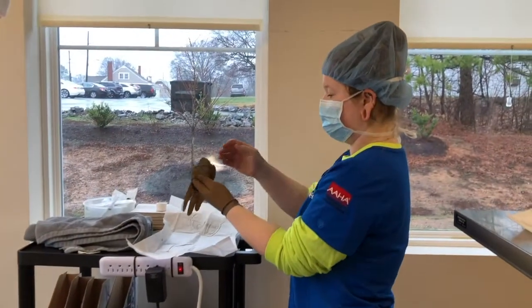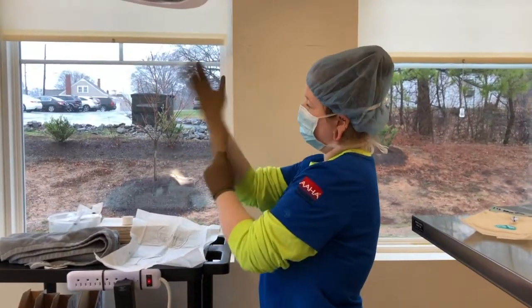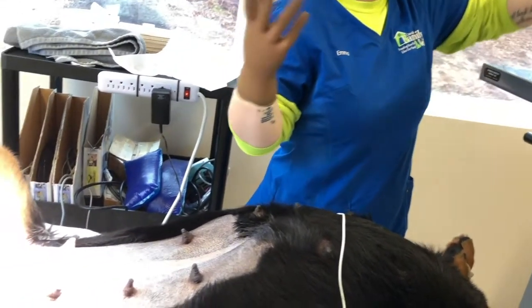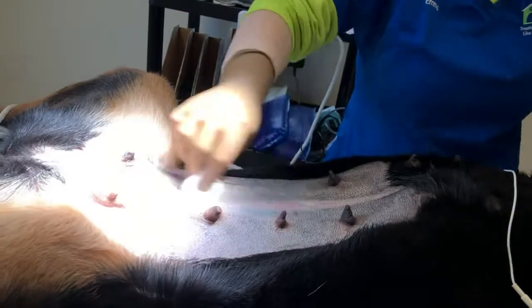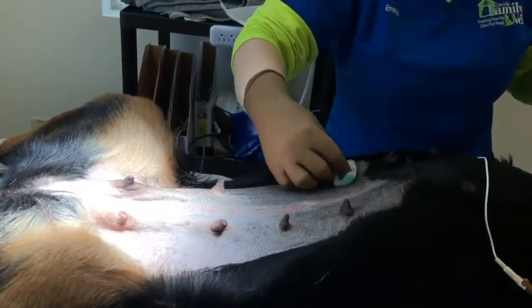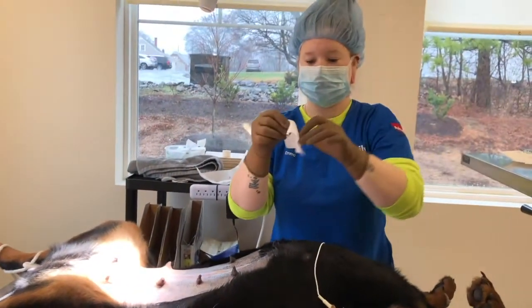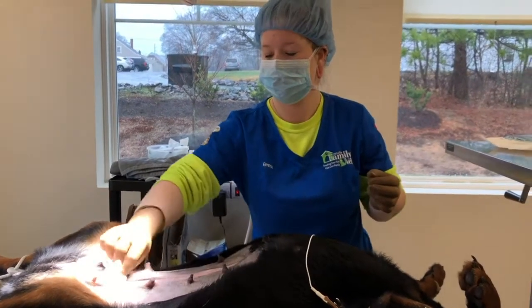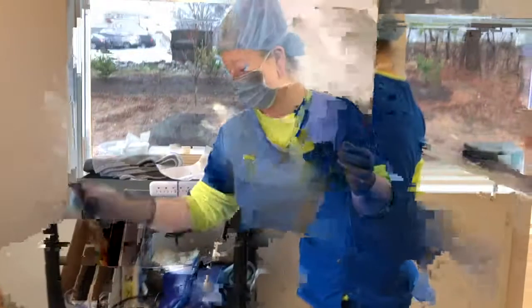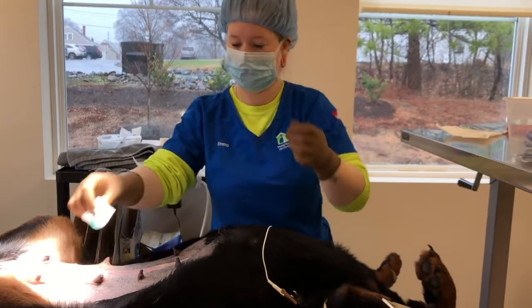Emma is now in the surgery room and she's putting on sterile gloves, so there's no bacteria on her hands at all. She's using sterilized gauze and will use the same circular technique — starting in the middle and working her way out toward the edge. She even uses her left hand to handle the sterile gauze and transfer it to her right hand, and the right hand touches the dog. This keeps potential bacterial contamination from going the other way.